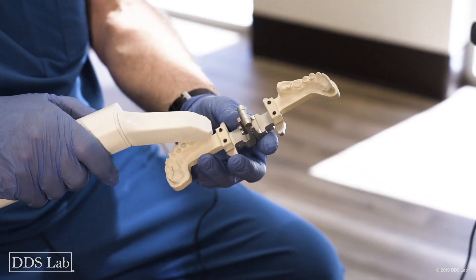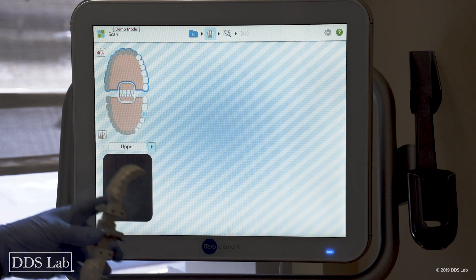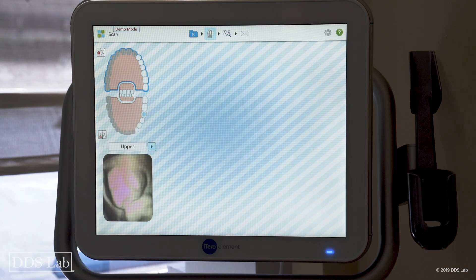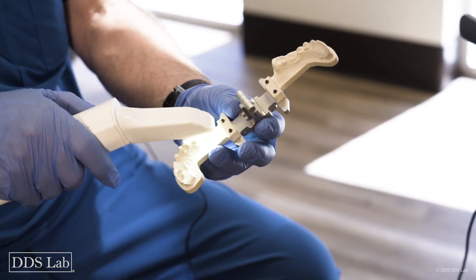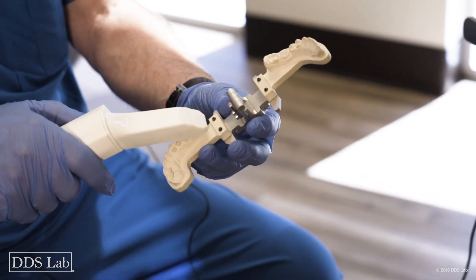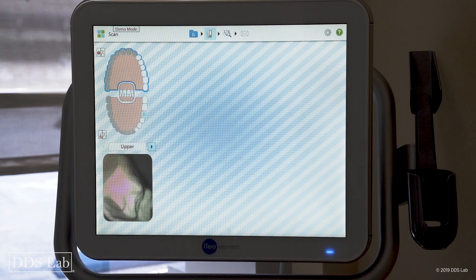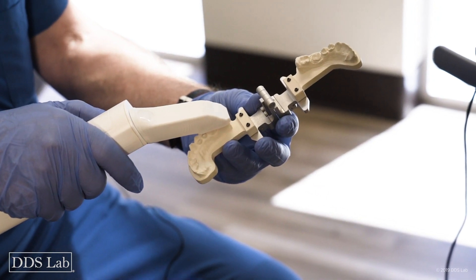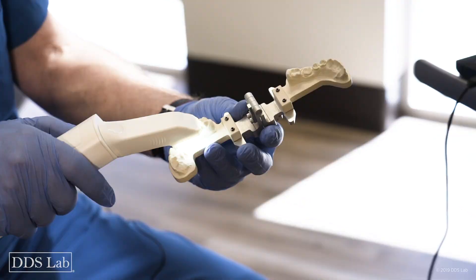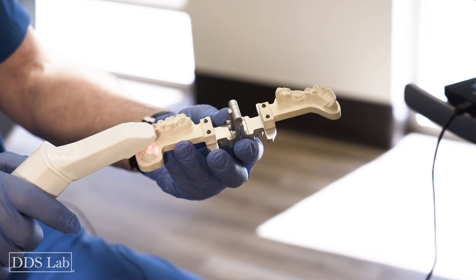I'm going to go ahead and start scanning, beginning with the terminal molar. As you can see in my viewer — this part — you can see where my camera is. If I have a problem with an undercut at the terminal molar, I have to move over a little bit cheek side and roll my camera backwards. I'm making sure I'm right on top of it and not going too fast.